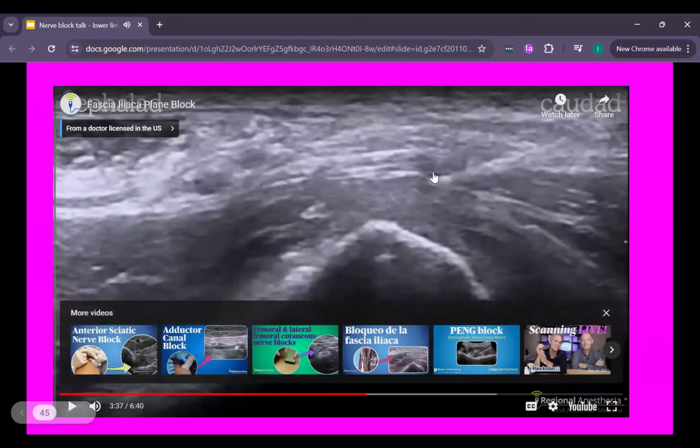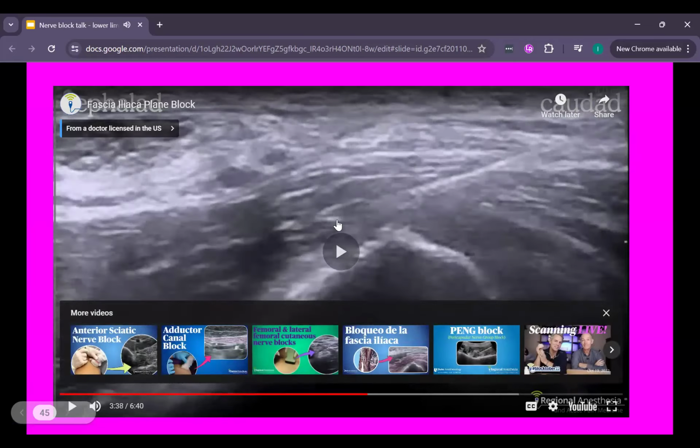So as you can see here, with our needle coming in from caudad, we're just aiming to get below those 2 fascias. So again, you use your tactile technique. Be sure to avoid the peritoneum, avoid these deep circumflex vessels, and we want to see a nice endpoint, which is spread on top of that iliopsoas muscle.